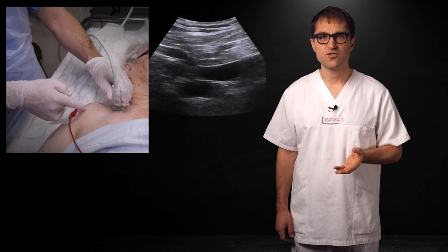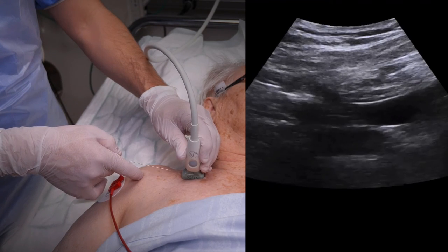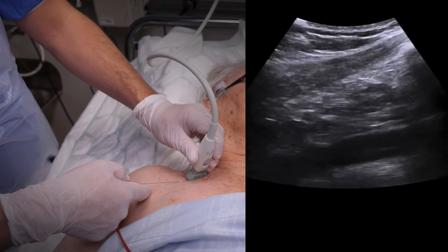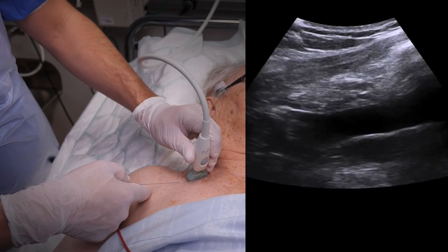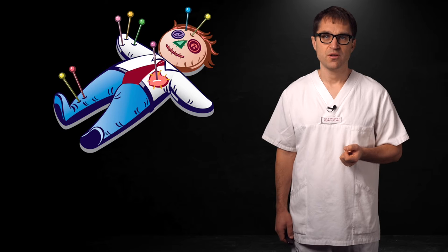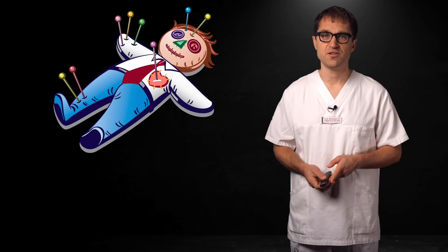You may need to adjust your puncture site based on the patient's external anatomy. In this patient, the shoulder is in the way for optimal needling. See how I make a slight rotation where I find a good puncture site without losing sight of the vein. Avoid multiple skin punctures — use the same site to avoid oozing. Rather than doing a new skin puncture, just do the superficial lateral displacement, which is easy in most patients.